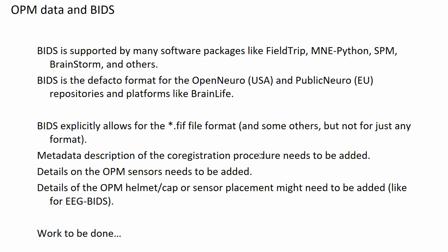BIDS is supported by many software packages like FieldTrip, MNE-Python, SPM, Brainstorm, and others. And it's also the de facto standard for the OpenNeuro and the public Neuro repositories, and for platforms such as BrainLife.